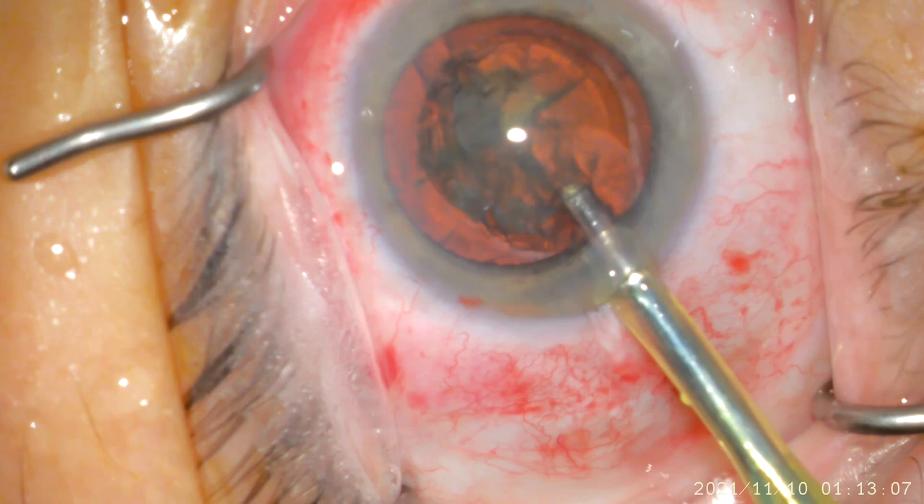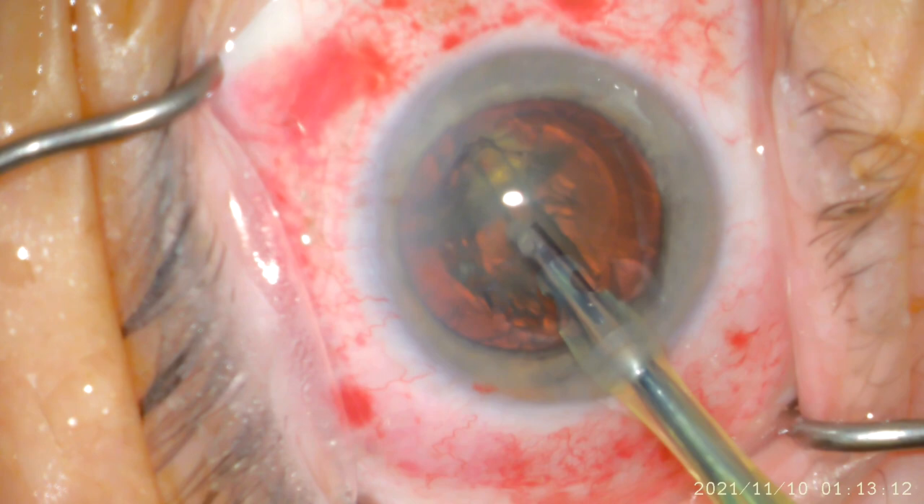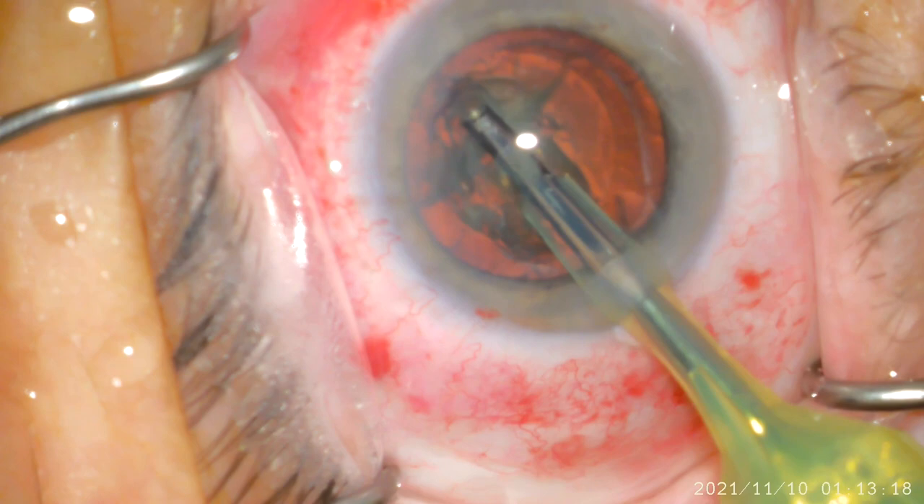I next introduce the FACO Emulsification Handpiece, or the FACO Handpiece, which is a minimally invasive tool that you see on the right hand side. It uses ultrasound pulses to break up the lens in a very gentle and controlled manner.